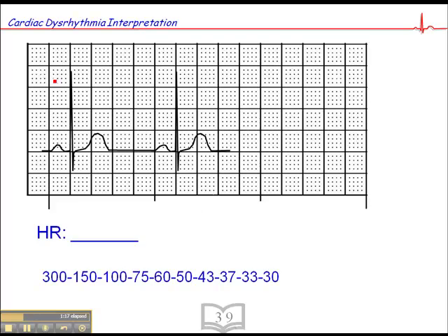Moving to the next one, here we find a QRS that falls more or less on a dark line. Counting forward: 300, 150, 100, 75, 60. So the heart rate is 60.